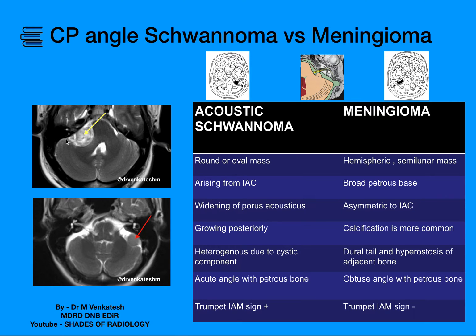Schwannomas are usually heterogeneous due to a cystic component — as you can see in this example, they have a few tiny cystic areas. Whereas meningioma is usually homogeneous, sometimes heterogeneous depending upon the presence of calcification or degeneration.